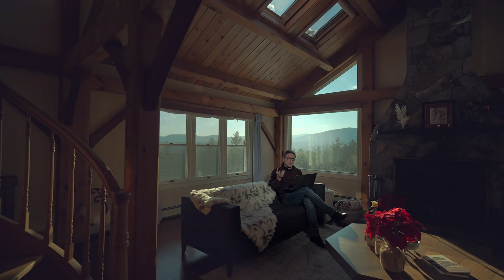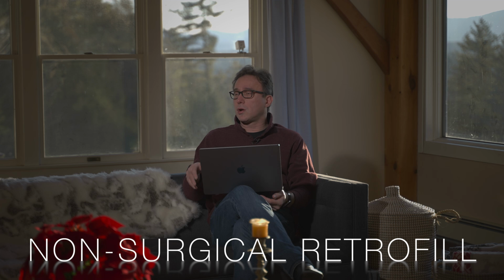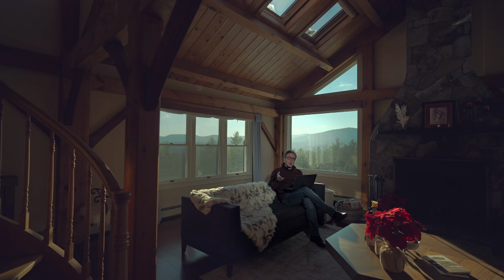So now, the technique that I'm going to talk to you about is this concept that I talk about as non-surgical retrofill. And the idea as a whole here, to just summarize it before I show it to you, is filling the apical portion of the root with a bioceramic putty, such as the BC Putty Fast Set, which is my preferred putty material, and then immediately going ahead and surgically cutting the root off. At this point, since you have your retrofill done with the putty at the apical portion, you no longer need to do a retro preparation and the addition of a retrofill from the other end. I hope that makes sense. After you see it, you probably understand what I'm talking about.